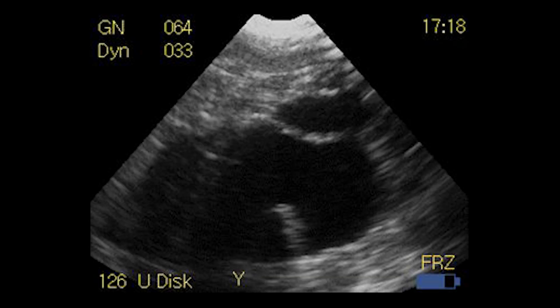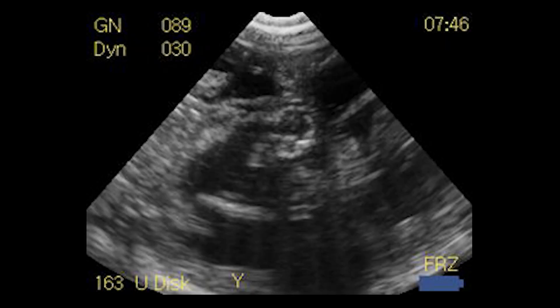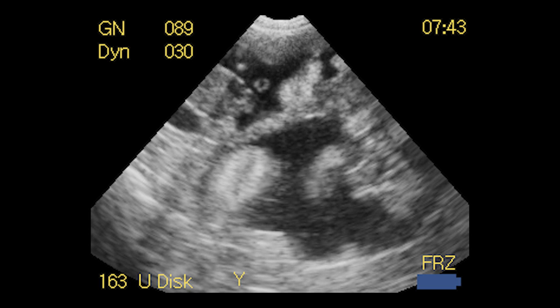Fluid on ultrasound shows up as black and the foetus and placentomes will be very reflective and bright white. The high contrast image of this machine makes spotting pregnancy using this scanner so easy.